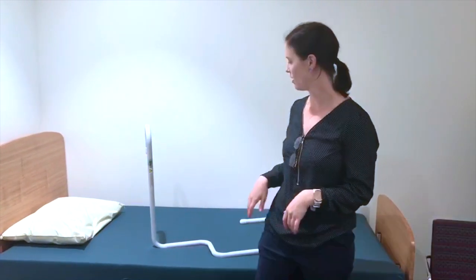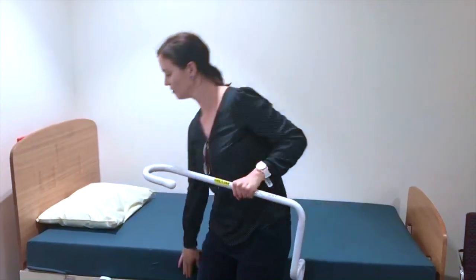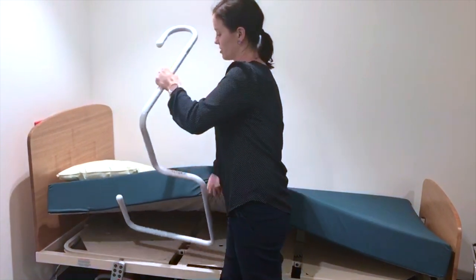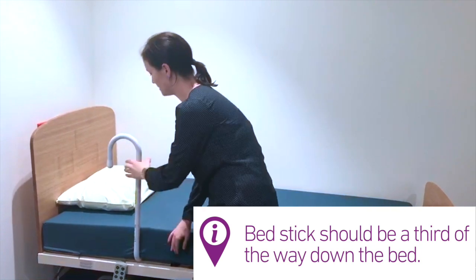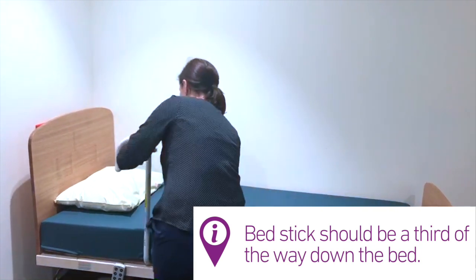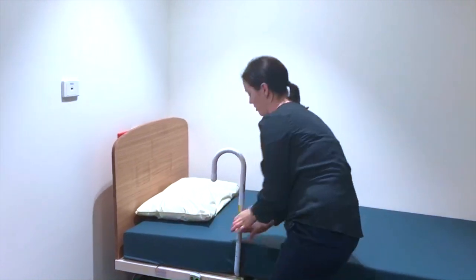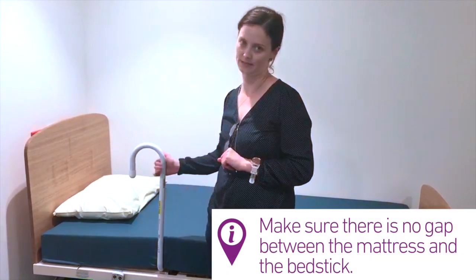To install the bedstick you'll likely need one or two helpers. You or your helper lifts the mattress up and places the bedstick under a solid bed frame. Ensure the bedstick is about a third down from the head of the bed and near the pillow — so round about here. It is important to make sure that there's no gap between the mattress and the bedstick.